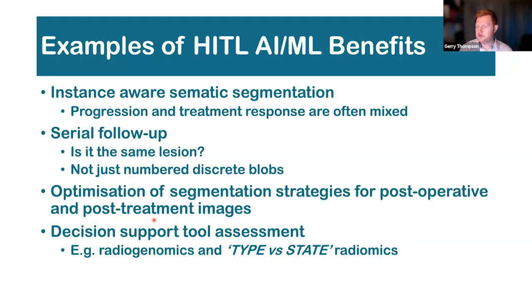If you want to come up with a standalone process, that's fine, you can use it. It may stand outside of the clinical radiological pathway. But in terms of a diagnostic software as a medical device class, at this point in time, it's probably more realistic and helpful to provide feedback to radiologists, and they use it and they decide what that's going to do in terms of changing their diagnosis or their certainty.